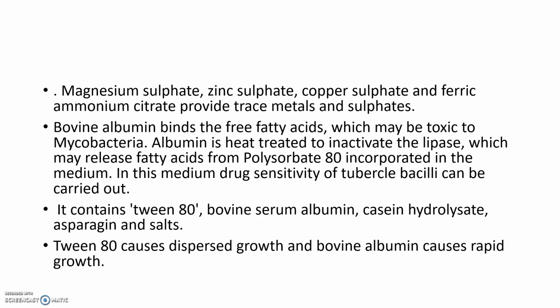In this medium, drug sensitivity of tubercle bacilli can be carried out, and it contains Tween 80, bovine serum albumin, casein hydrolysate and asparagine and salts. Tween 80 may cause dispersed growth, and bovine albumin causes rapid growth.